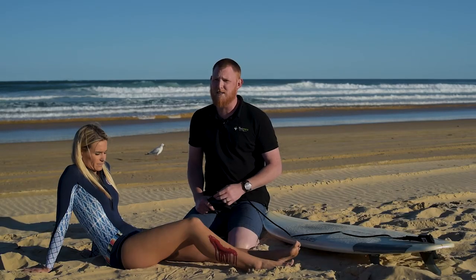Major injuries in the surf like shark attack, boat propeller injuries, major fin lacerations and big wipeouts can all cause major bleeding — and that's where the Omni-Tourniquet leash comes in.